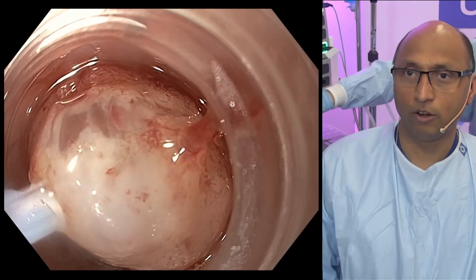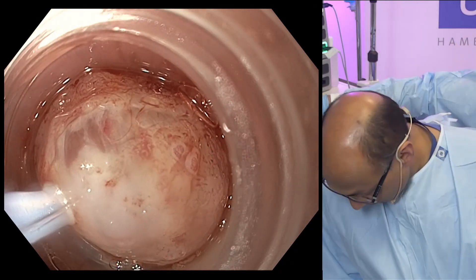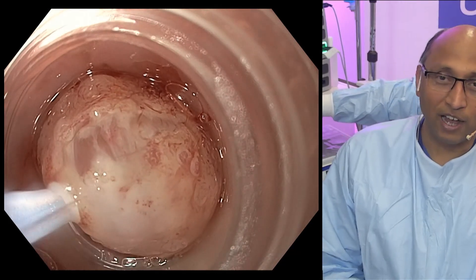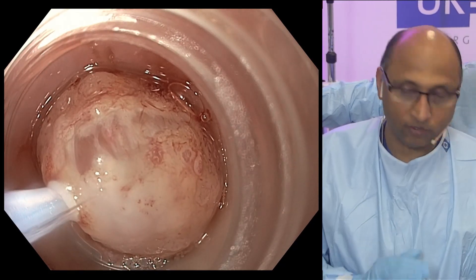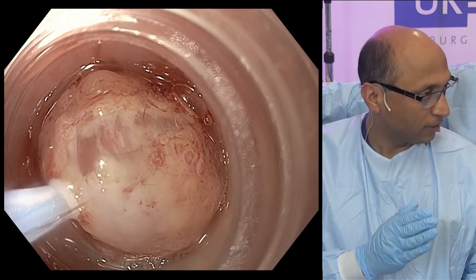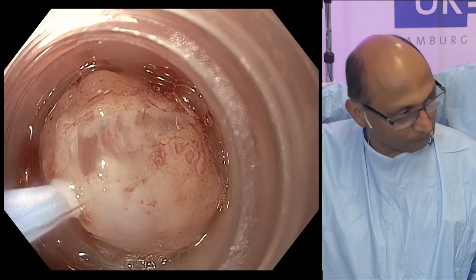I can let it out and have a look. Looks happy. Seeing your technique makes me happy. Now there's no rush — I'm in control. I'll talk to my nurse and explain the instructions of how fast or slow we're going to go. I'll start cutting at one and by the time I reach three we will go through. One, two, three — and we are finished. We'll start slowly: one, two, and three.